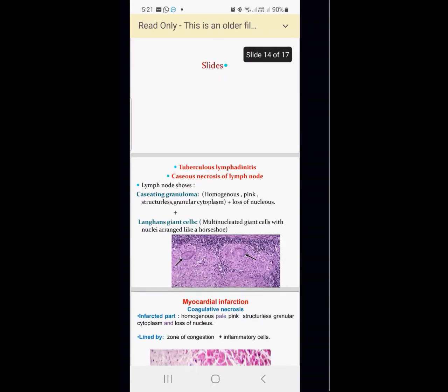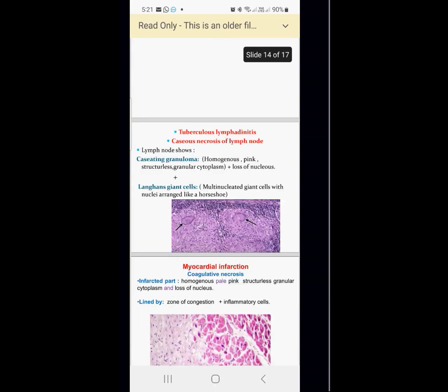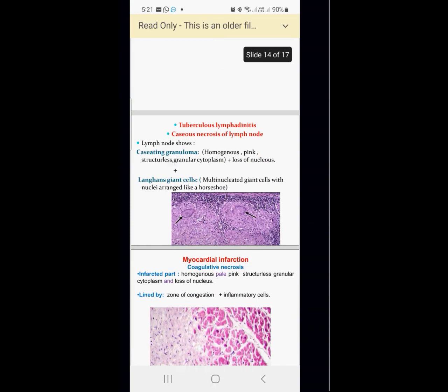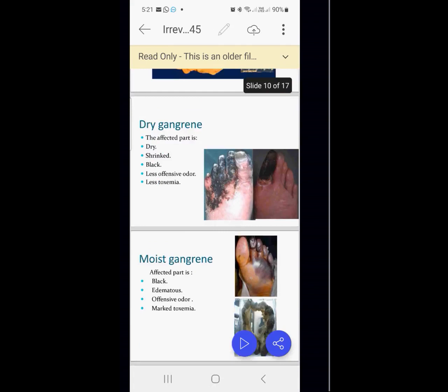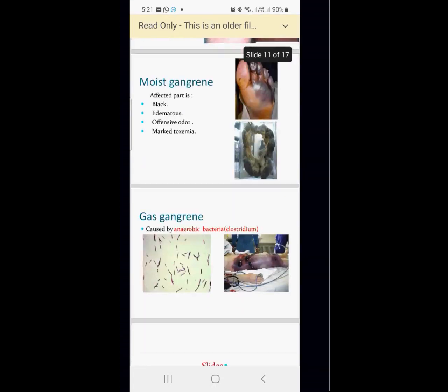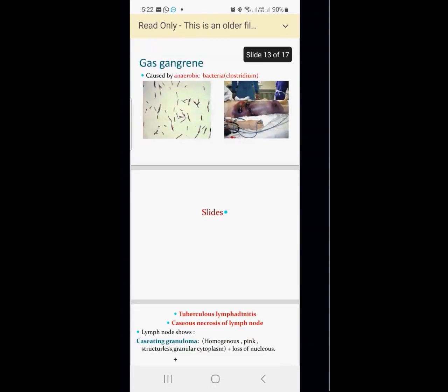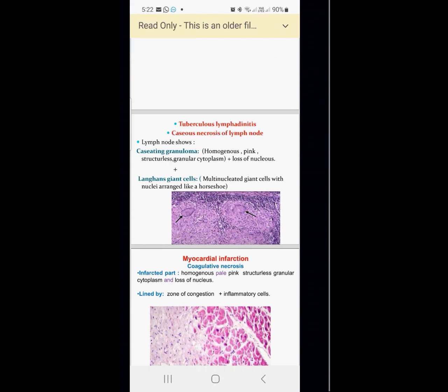طيب, tuberculous lymphadenitis, these are the gross macroscopic features of the necrotic features and different type of necrosis. Under microscope, the tuberculous lymphadenitis are causing necrosis of the lymph node بتكون caseating granuloma. Usually the preferred characteristic بتكون different multiple circular necrosis with caseating material in the center. Very characteristic. لو شفتها تاني will never forget it.